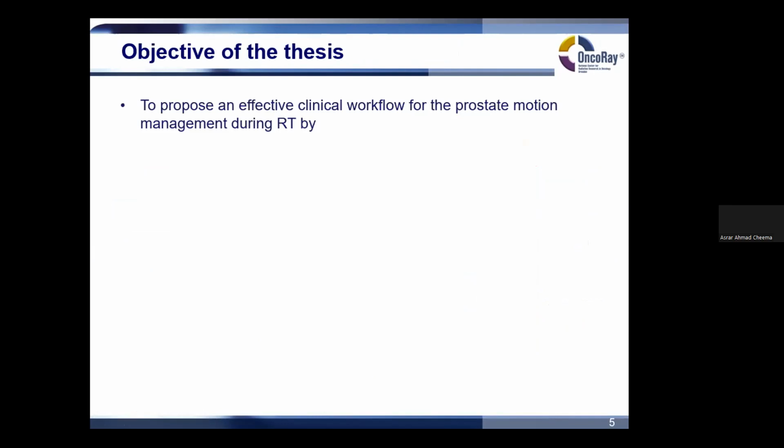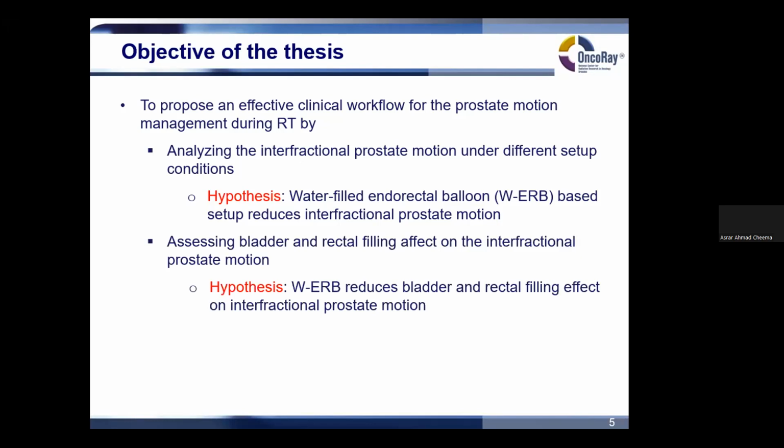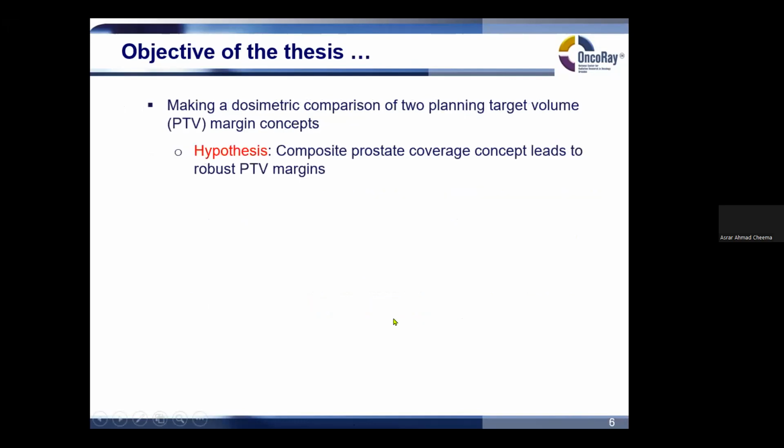The objective of my thesis was to propose an effective clinical workflow for the prostate motion management during radiotherapy by analyzing the interfractional prostate motion under different setup conditions. The hypothesis of the study was that water-filled endorectal balloon-based setup reduces interfractional prostate motion. In assessing the bladder and rectal filling effect on the interfractional prostate motion, the hypothesis was that the water-filled endorectal balloon reduces bladder and rectal filling effect on interfractional prostate motion.